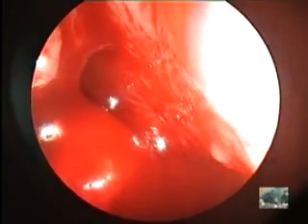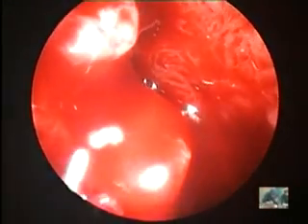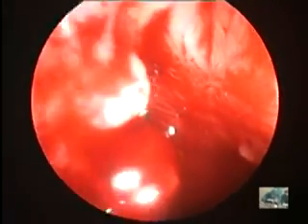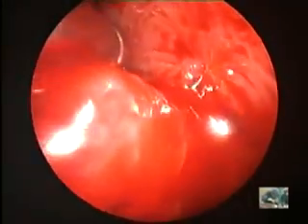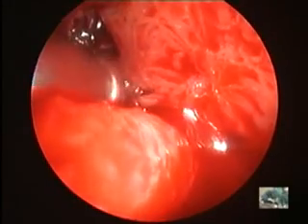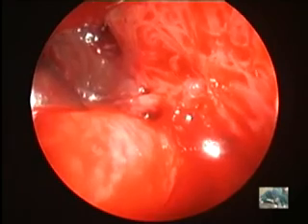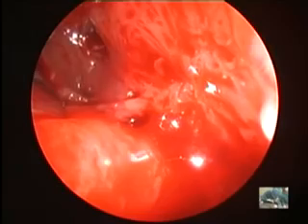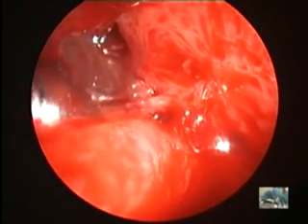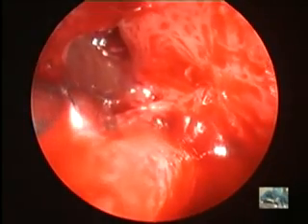Curved sucker. Now this is the opening. Yeah, okay. Nothing inside from this point of view. Okay, that's good. We got better visualization now.